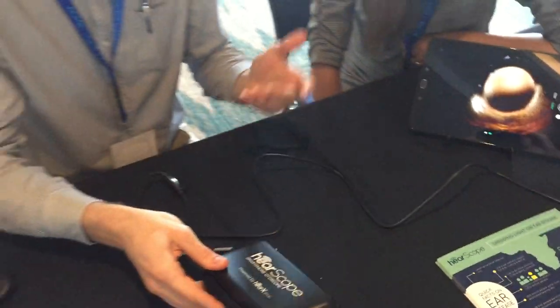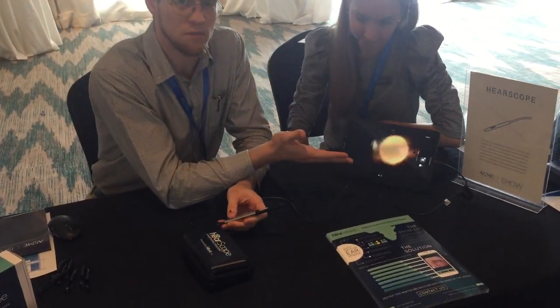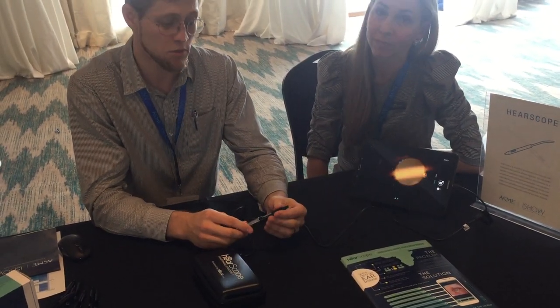You can use it with a smartphone or a tablet — basically any Android-based device. Just plug it in and download our free app from the App Store.